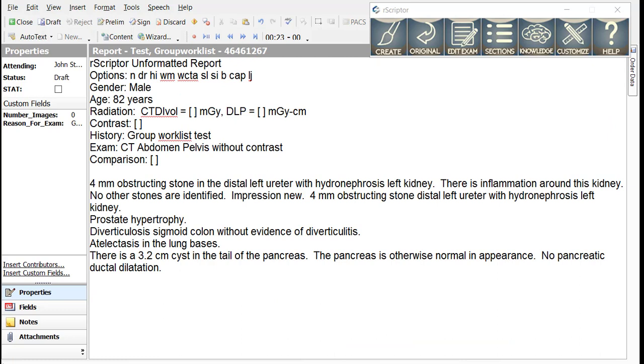The second keyword is impression period. It works like impression new period, except that all the text before impression period goes into the findings and impression, while the text after impression period only goes into the impression. Let's apply that reasoning to the remaining text of this report.